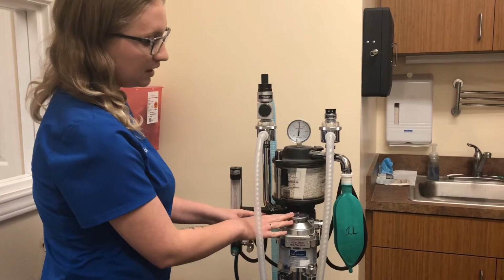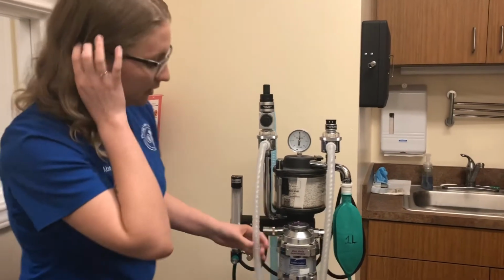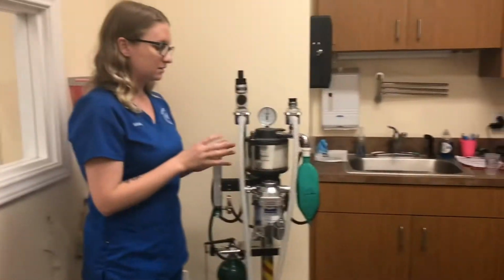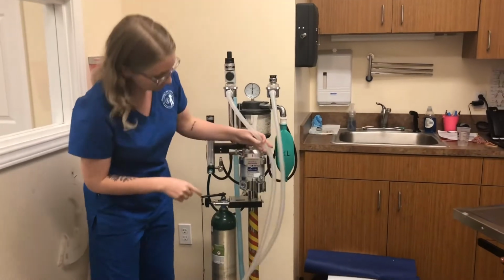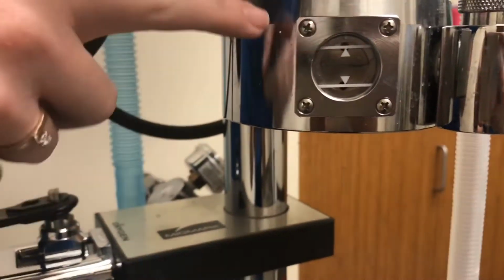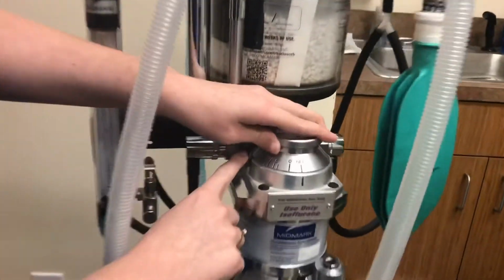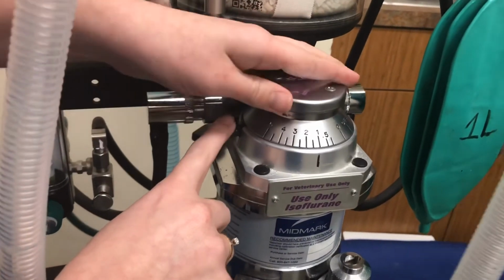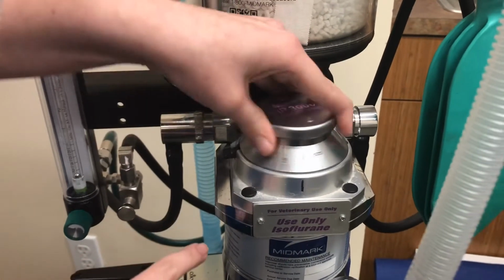This takes your liquid anesthetic, which we use isoflurane here, and it vaporizes it and mixes it with the oxygen and becomes the anesthetic gas. If you look here, this shows you how much isoflurane is in your machine. This is considered enough, but up to the line would be totally full. Then you can pick the percentage that you want. It goes anywhere from 1% isoflurane to 5%. It'll mix and it'll flow into your tubes.